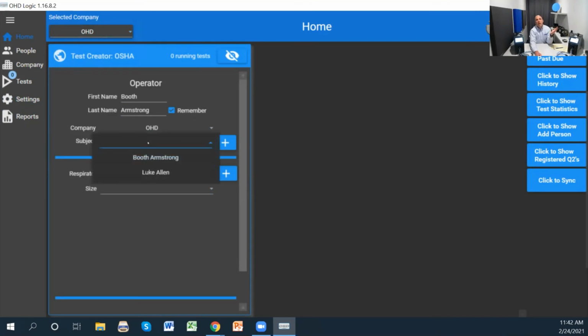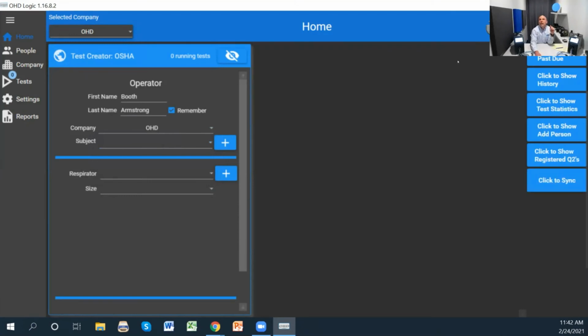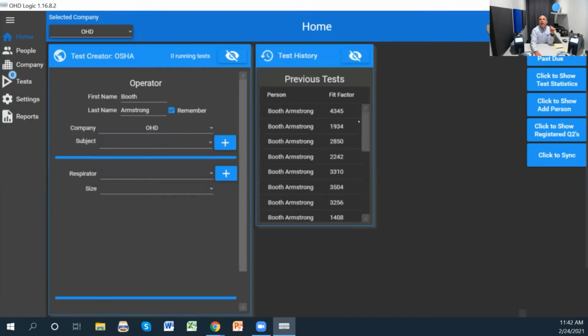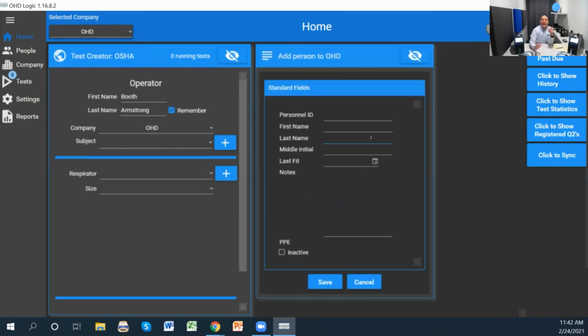So when I hit subjects, it's only OHD employees. I can also come right over here and get a quick look at if anybody's past due for a test at OHD. I can take a quick look right here and see my testing history. What test have I done at OHD? I can click right here and quickly add someone to OHD on the fly.